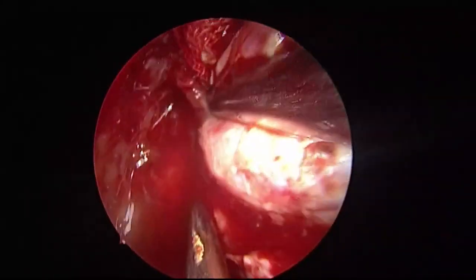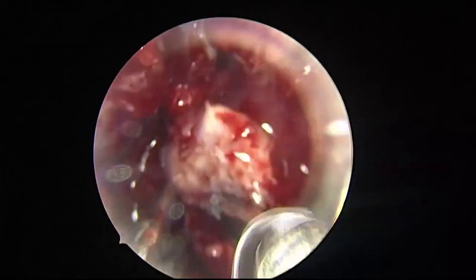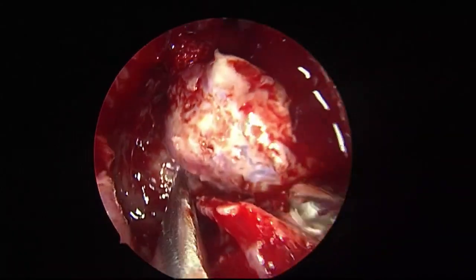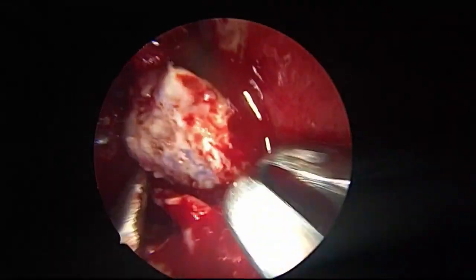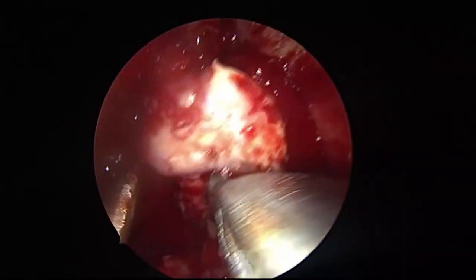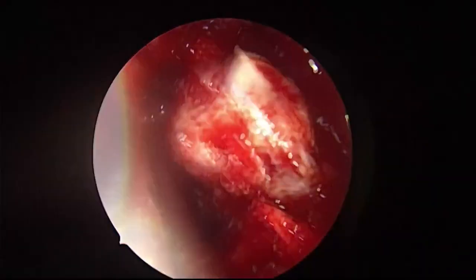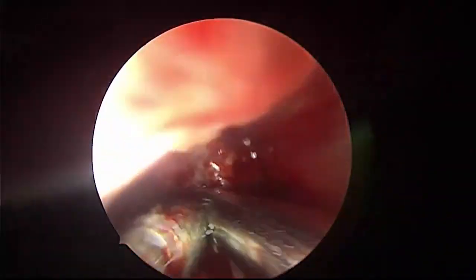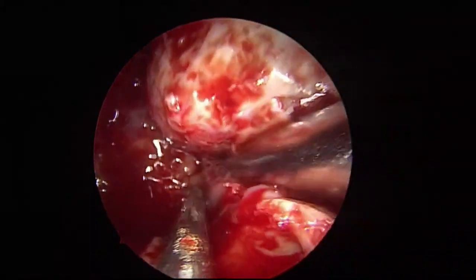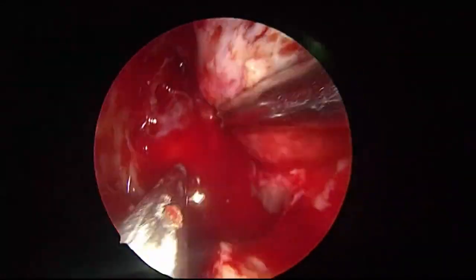See, my direction of the blade is away from the tumor. See that? Much better exposure of the posterior wall now. This tumor is like a pot in the anterior nasal cavity. Such a big tumor, usually a component coming anteriorly generally doesn't come. I told you in the beginning that this will definitely make our life difficult and we have to do something to it.